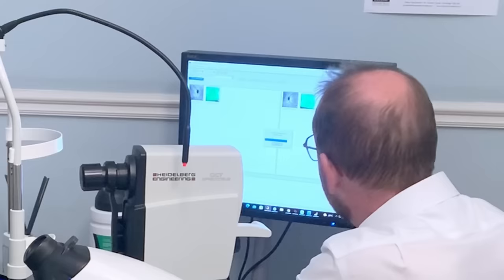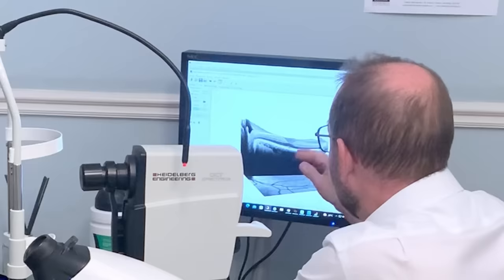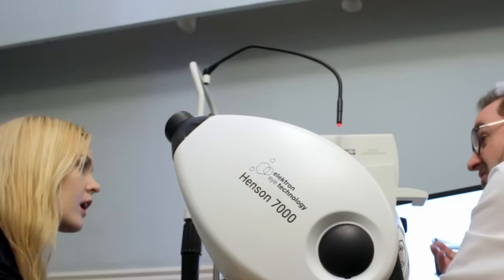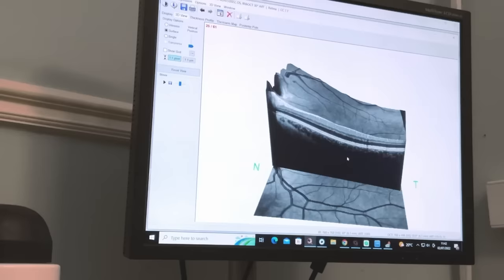Occasionally you get patients that come in with vision problems, and the centre of their macula has completely come away. You'd know about it because you wouldn't have very good vision. Okay, let's just slide through this one as well and make it a bit bigger.